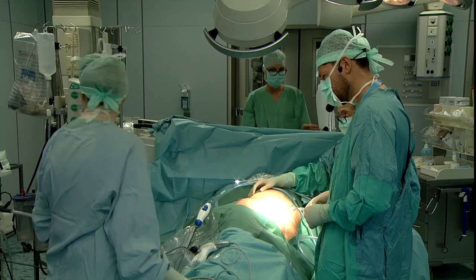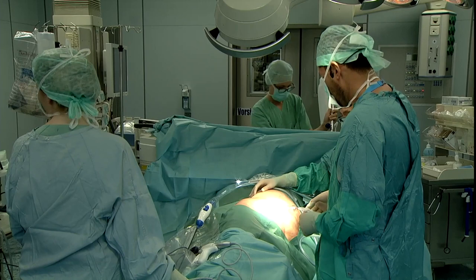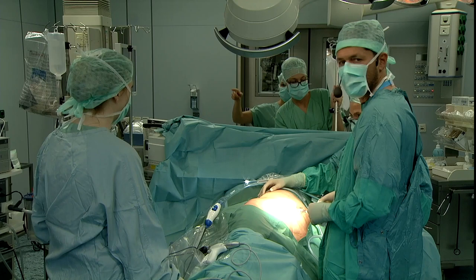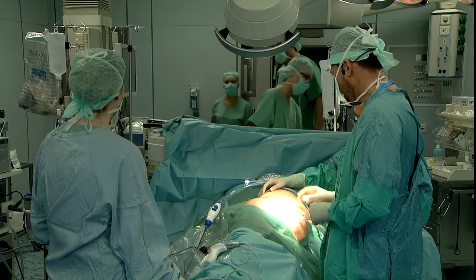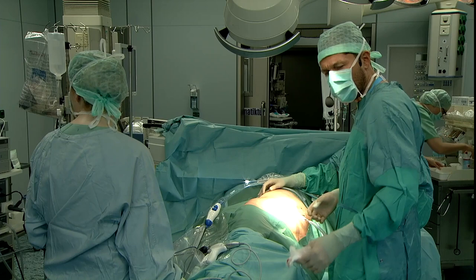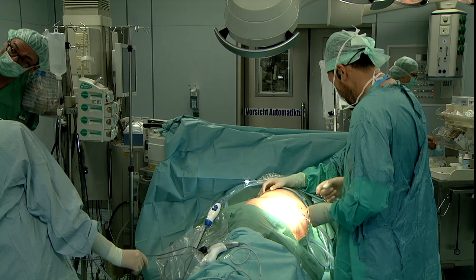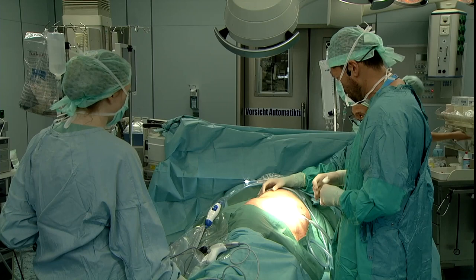Okay, so this is a lady who was diagnosed with upper tract urinary cancer, high grade, on the right ureter, approximately 3 to 4 centimeters in size. I think they already showed the CT scan and the urography, and therefore she was scheduled for a right nephroureterectomy. Also, she has a very dilated system, and the kidney looks very bad, so I don't think there's any function left on this kidney. So the way we will approach this is via a laparoscopic radical nephroureterectomy.